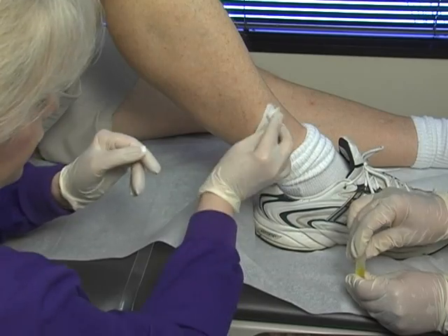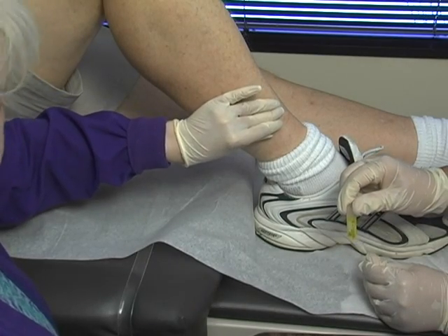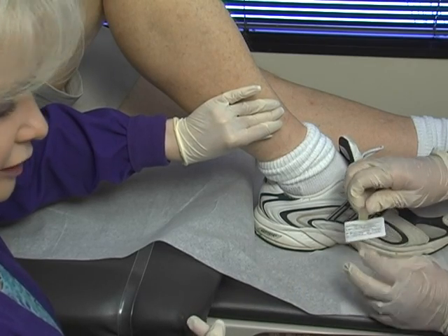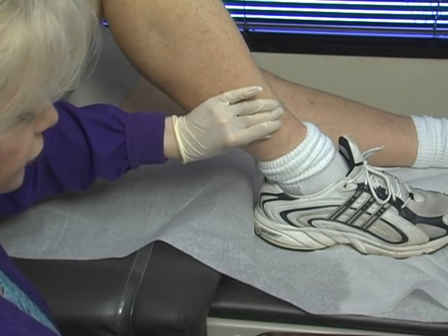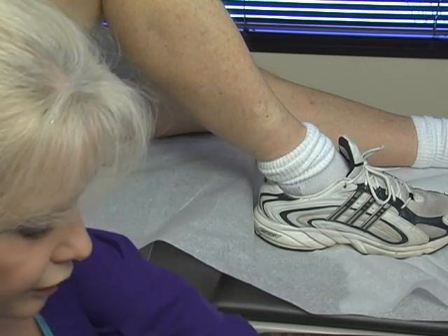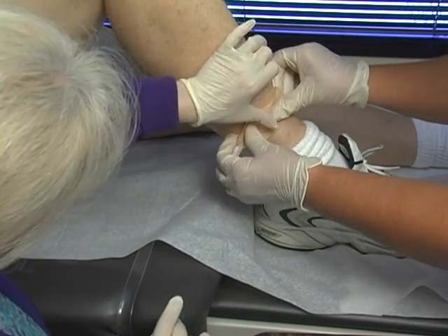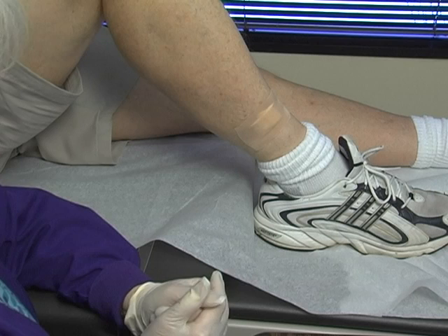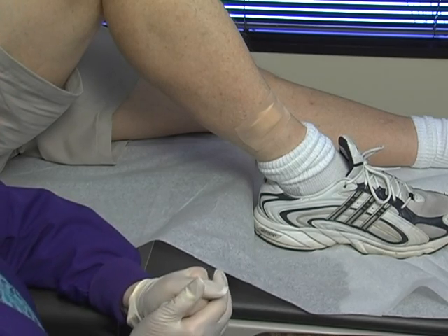Lynn and I like to use what we call our double labeling system. We make out the labels — whether we're doing right or left, thigh or calf — ahead of time, but we don't label our tube until the sample is already in there. If you pre-label your tubes, you run the risk of picking up the wrong one and then you can't identify that you've made the transfer incorrectly. We'll fold up a little two-by-two, place that over our biopsy site, and apply our pressure dressing. Pressure dressings are not necessary — you can use a simple band-aid — but they can ooze for the next 24 hours, which is not unusual, so we like to apply pressure now.